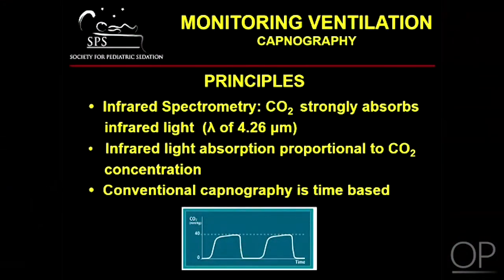A more commonly used tool for measuring ventilation is capnography. This technique is based on the infrared absorption of gaseous carbon dioxide and can be used to both measure the concentration of carbon dioxide in exhaled air and the frequency and flow of exhalation, which corresponds to important ventilatory parameters. This image depicts a typical capnography waveform that is time-based.